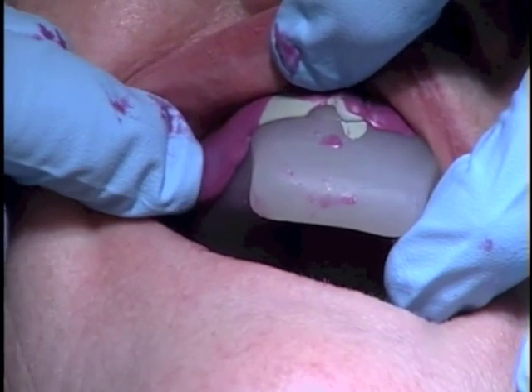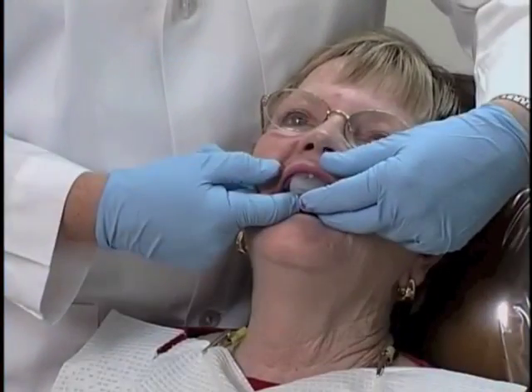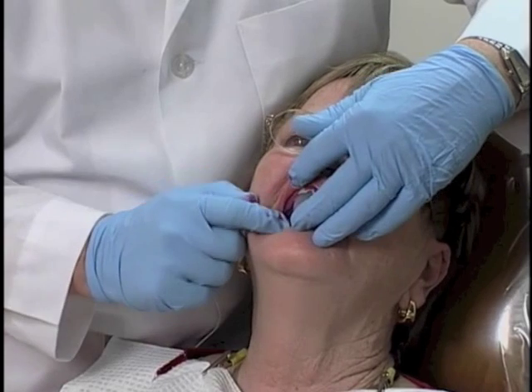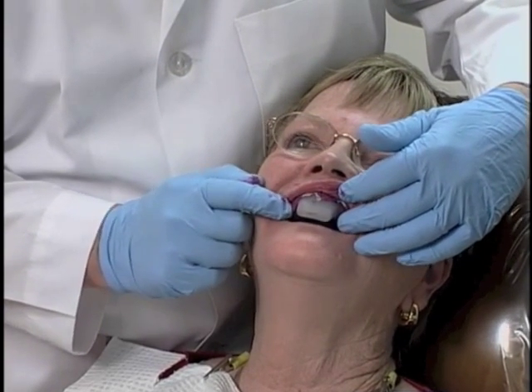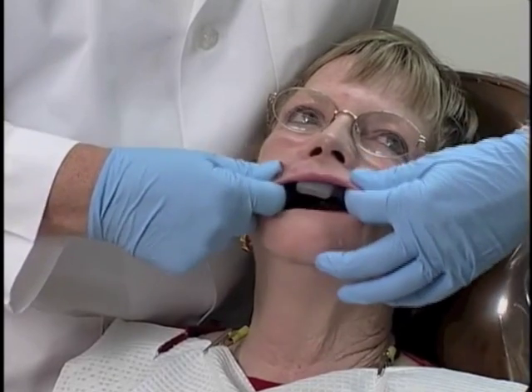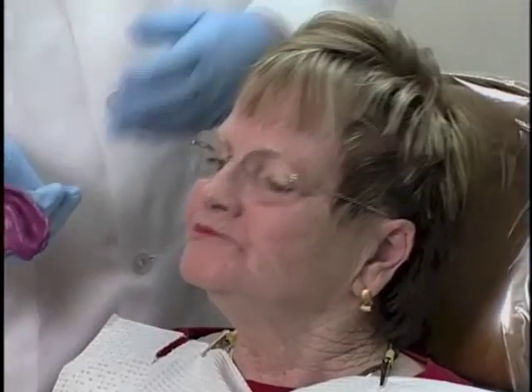If it doesn't, such as what we have right here, see, that didn't rebound all the way, and that material is not quite set. When you think the material is finally set, if you'll poke it again with a fingernail, and we see that that does not leave a fingernail imprint on it now, that means that material is totally set. We can now remove it from the mouth. So the way we do that is just to work the cheeks just a little bit, and then remove the impression from the patient's mouth.